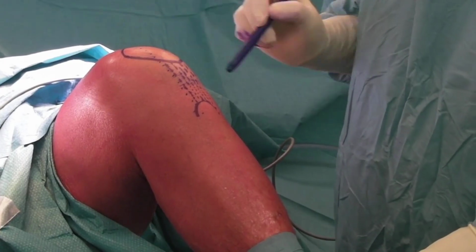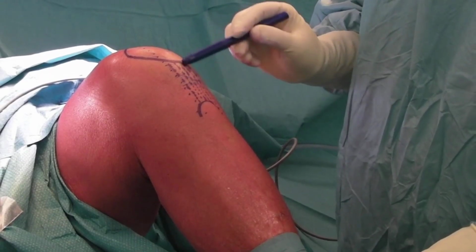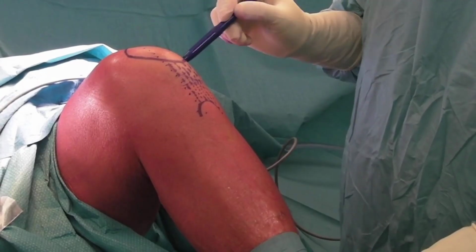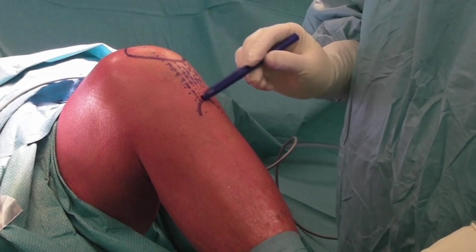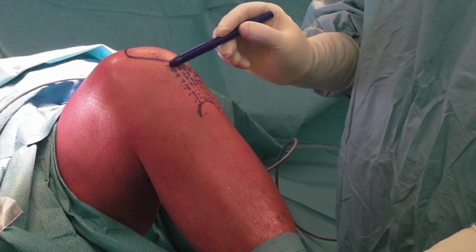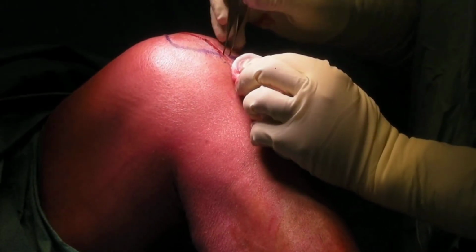The surgery is performed with the patient lying on their back. The anatomical landmarks, represented by the patella, the tibial tuberosity, and the tendon located between them, are identified, and then a surgical incision is made, the length of which varies from patient to patient.